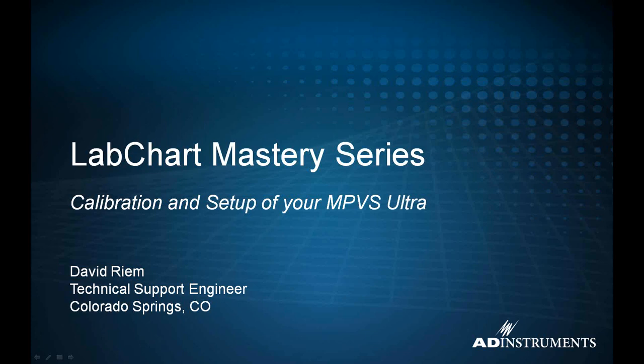Today we're going to cover calibration and setup of your MPVS Ultra unit for using with PV Loop recordings.